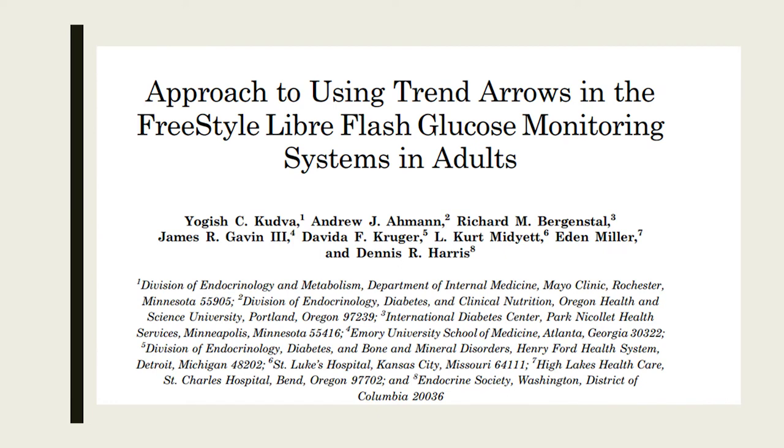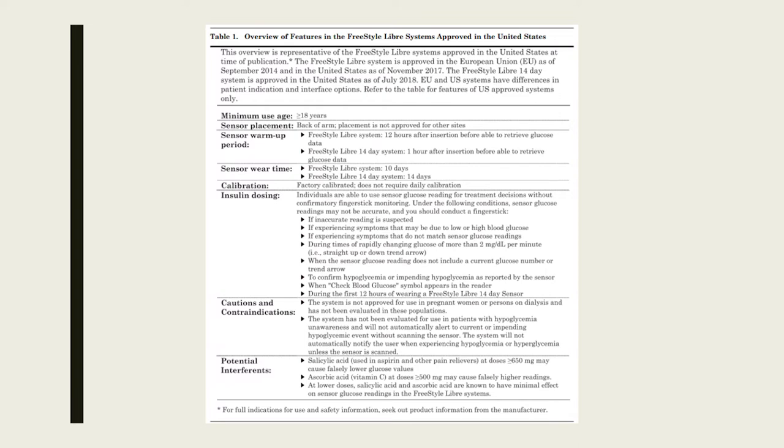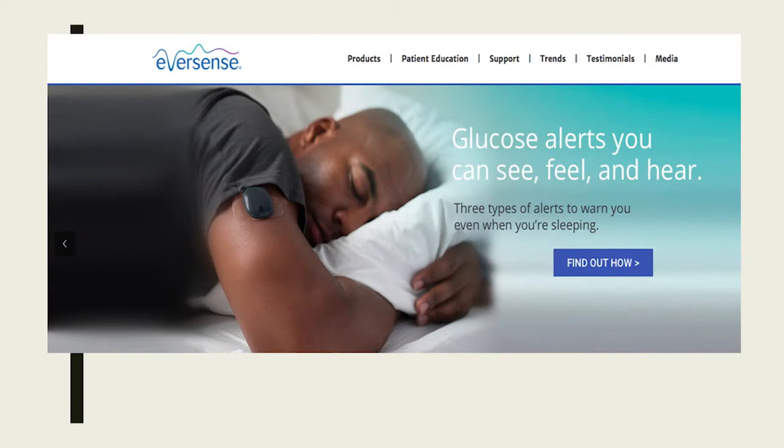So again, they've developed systems for adjusting your insulin doses based on the trend arrows. Some of the potential interactions: the Dexcom G5 was interfered with by acetaminophen. The Libre is affected by high doses of aspirin, not your normal prophylactic doses, but doses over 650 milligrams, so kind of your goody powder doses, as well as high doses of vitamin C. So for all those who are seeing their wintertime commercials about your immune system and taking high doses of vitamin C, that can certainly have an impact. Different substances can make them read higher or lower. Most of the time, the substance is making them read higher, but one of the sensors can be impacted by tetracycline antibiotics and make them read a little lower.